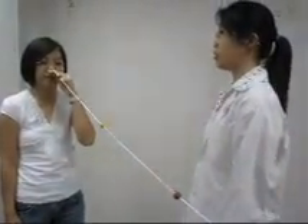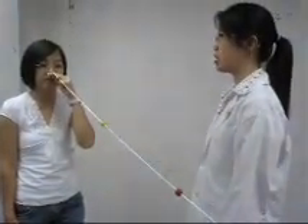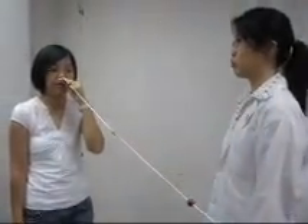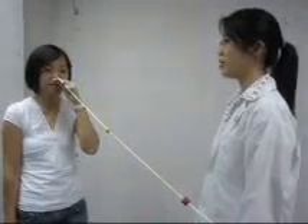Now I'm going to train the ability of your eyes to converge and appreciate physiological diplopia. Please follow my instructions on which bead to focus at, and tell me what you have seen.